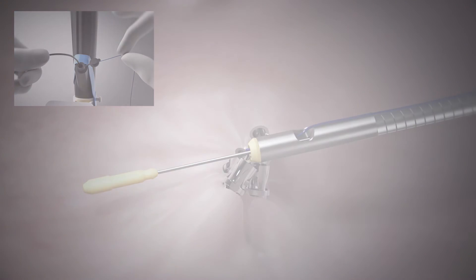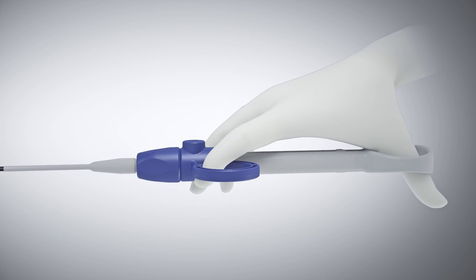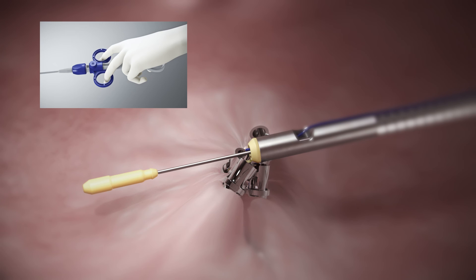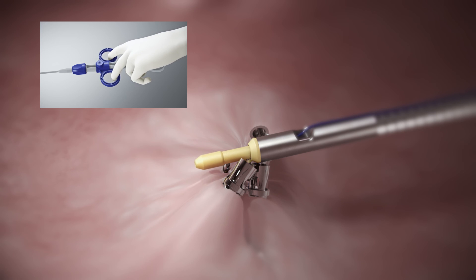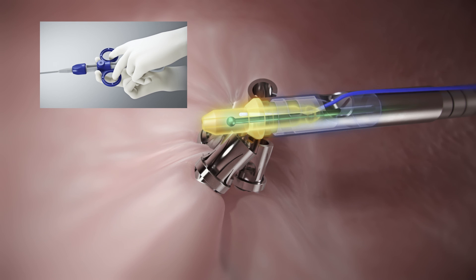Open the cinch handle with the palm facing down — this will release the safety mechanism. Deploying the cinch is completed in three stages. Stage 1: squeeze the cinch handle with one hand to pull the peak plug into the peak collar and lock the suture. Stage 2 of deploying the cinch will require two hands. Continue to squeeze the cinch handle to advance the beaded rod through the peak plug.